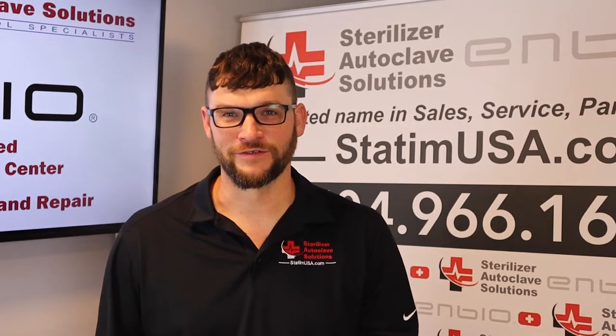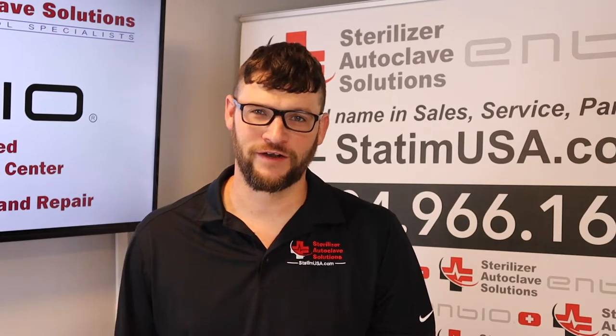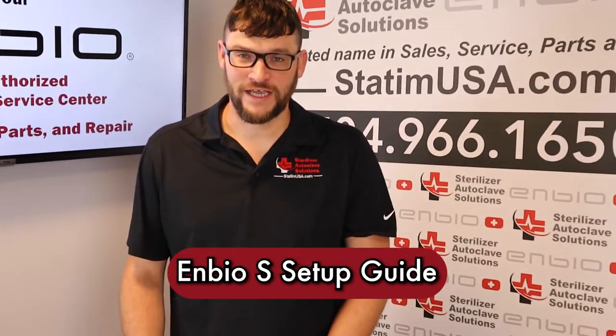Hi, this is Ian with Sterilizer Autoclave Solutions, your United States authorized warranty and service center for the Enbio S. We also offer sales, service, parts, and repair. Today we're looking at the Enbio S and how to set this unit up.